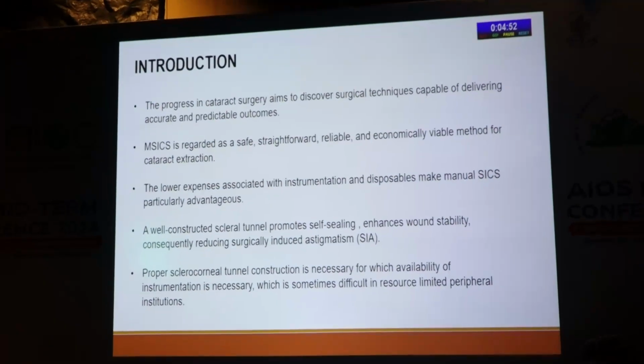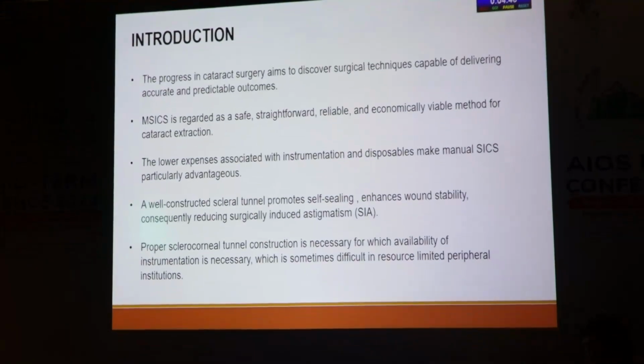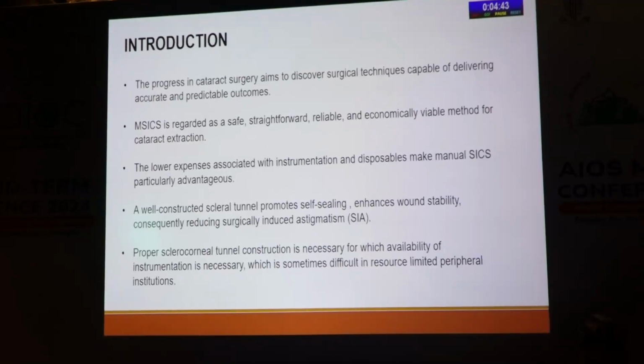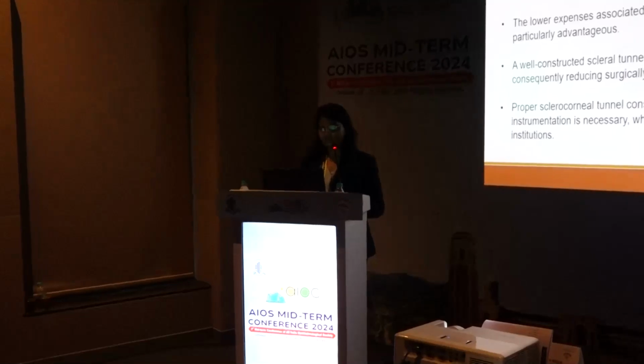Introduction. The progress in cataract surgery aims to discover surgical techniques capable of delivering accurate and predictable outcomes. Manual small incision cataract surgery is regarded as a safe, straightforward, reliable and economically viable method for cataract extraction. The lower expenses associated with instrumentation make manual SICS particularly advantageous.